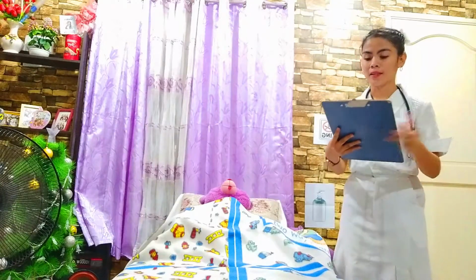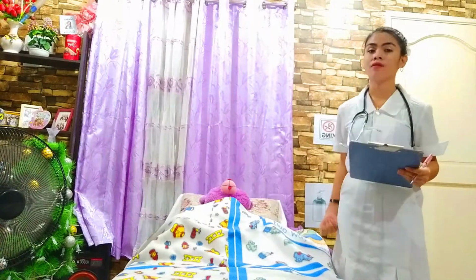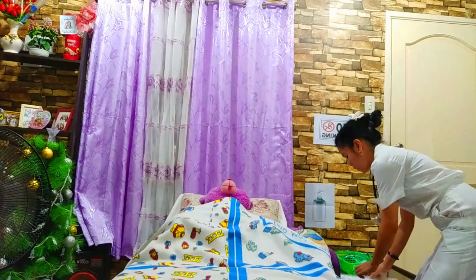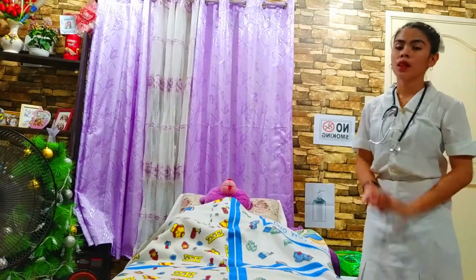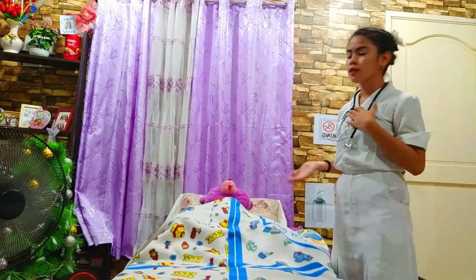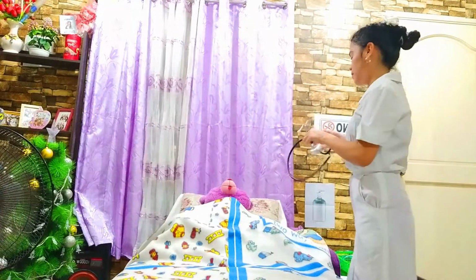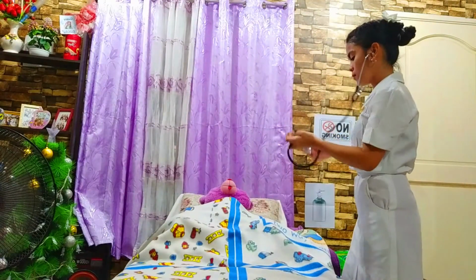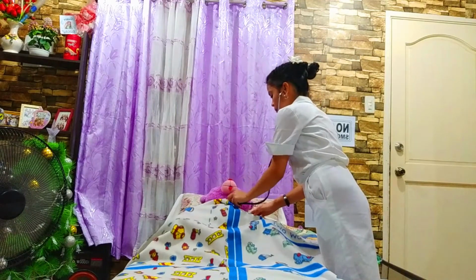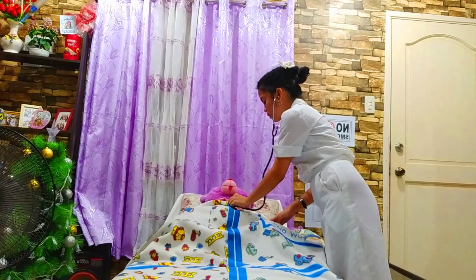First is the assessment. We have to determine the current vital signs and the level of consciousness of the client. So we need to get the pulse rate, the respiratory rate, and the breath sounds of the client by auscultating his chest. Can you breathe normally po?